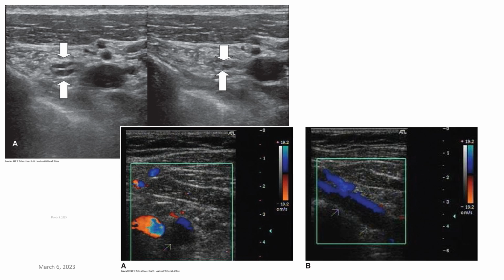Okay, so here's just a demonstration of a vein here that does not collapse versus one that does fully collapse. Here you see a transverse image of a vein lumen, and you see only partial fill here, so it's difficult to detect that thrombus in B mode, but on transverse you see that it certainly isn't filling with color or flow, so there is some thrombus having a mass effect on the blood flow in that lumen. Here we see that same vessel in long, and if this is our whole lumen, there's a very small portion of it allowing blood flow through, so that would indicate more of an acute type thrombus.